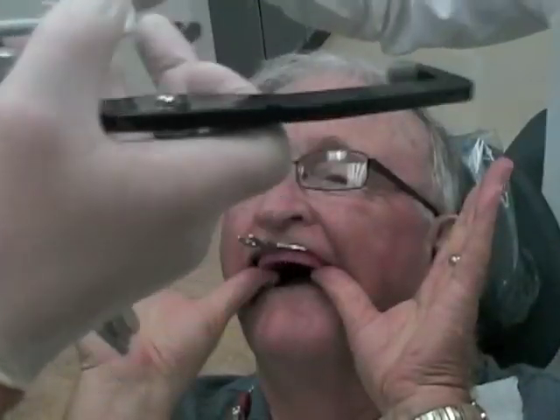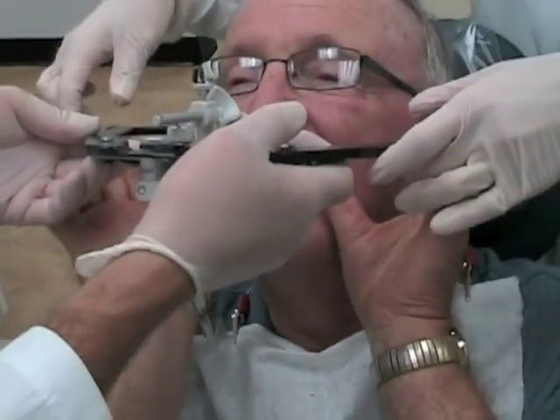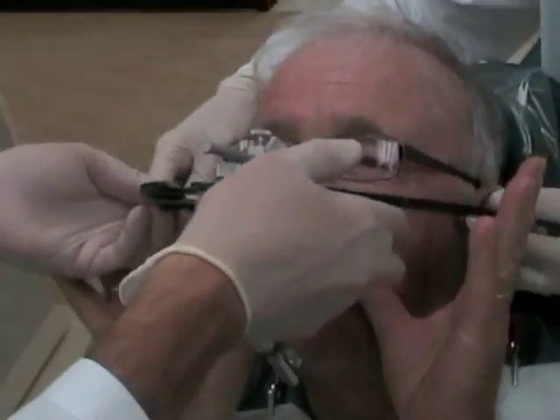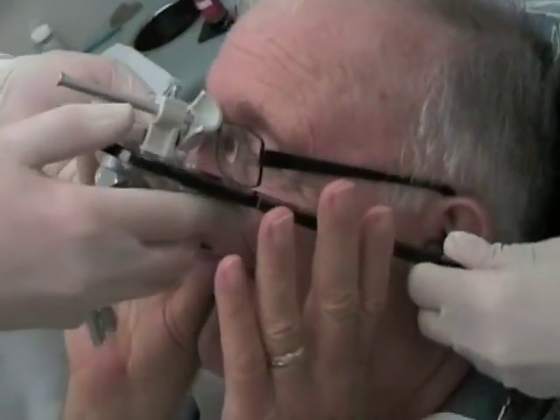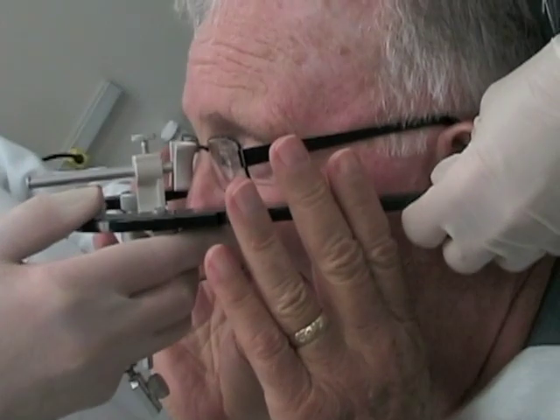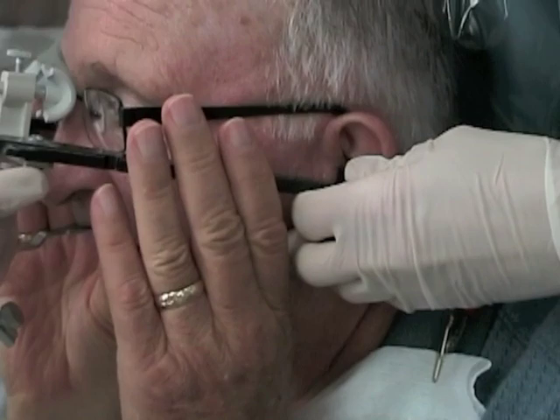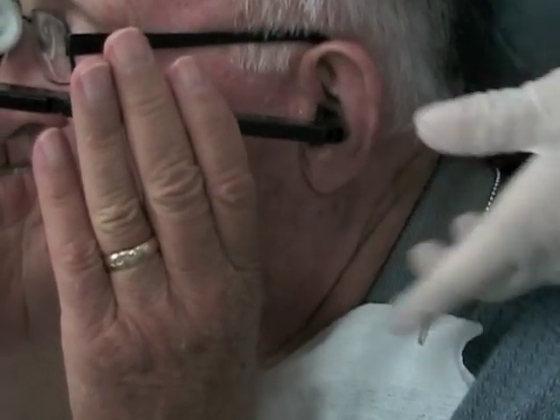Normally you will remove eyeglasses from a patient who wears them, but in this case the eyeglasses won't interfere with the face bow transfer. Next, attach the face bow to the bite fork and insert the ear pieces into the external auditory meatus. Rotate the nasion support so that it is oriented properly, make sure that everything is aligned, and press the nasion support into the nasion.